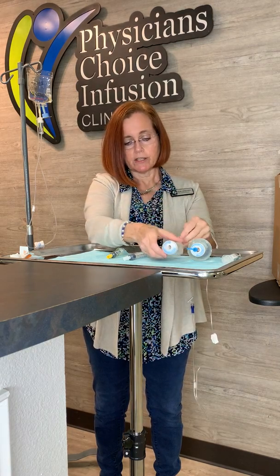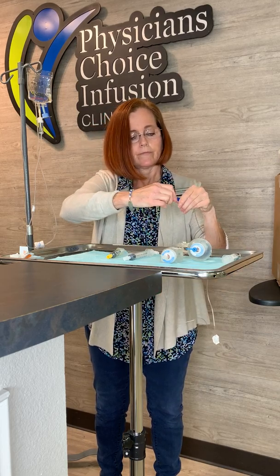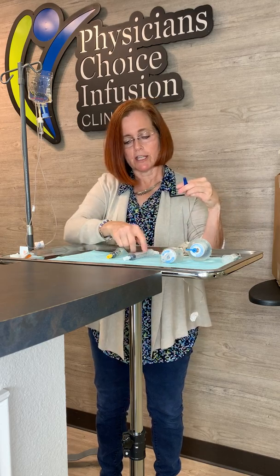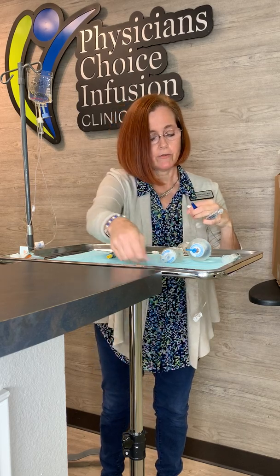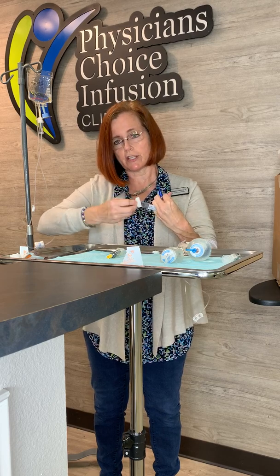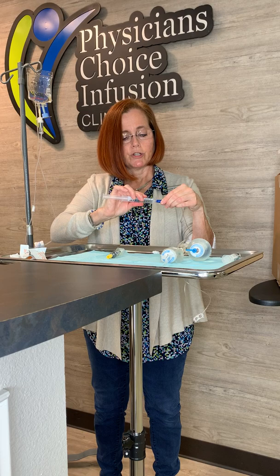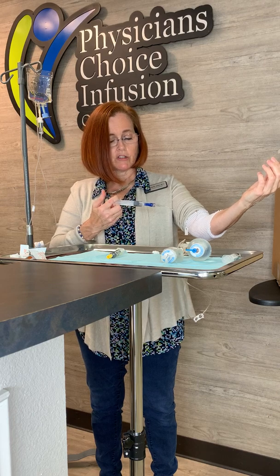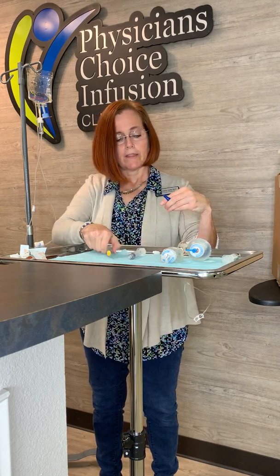Once the medication has infused and is done, clamp it to stop it, then disconnect your medication. Don't touch the end of the port — keep it clear. If you touch the end of the syringe, take alcohol and clean it for 15 to 30 seconds. Make sure you don't touch your blue port either; if you do, clean it as well. With both clean, go straight on, push and turn, and it's on. Then pump and release, pump and release — we want to push the rest of the medication through the line so it all gets into your body and the line is cleared. Then remove it and use your heparin next.